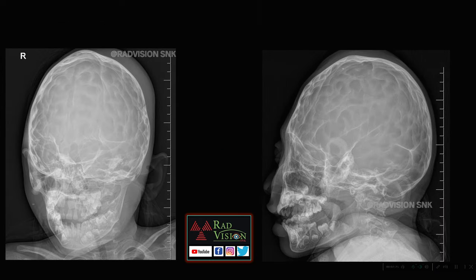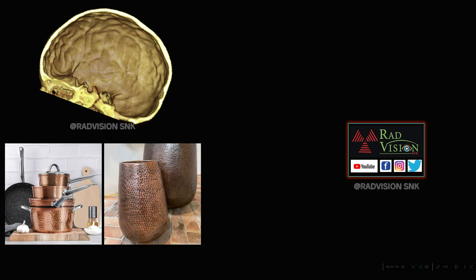Next is another child with multiple lucent areas and markings on the inner surface of the skull, causing remodeling. Whenever you see this appearance, do a CT scan along with 3D volume rendering images. These are prominent convolutional markings on the inner surface of the skull due to chronic compression by the gyri.